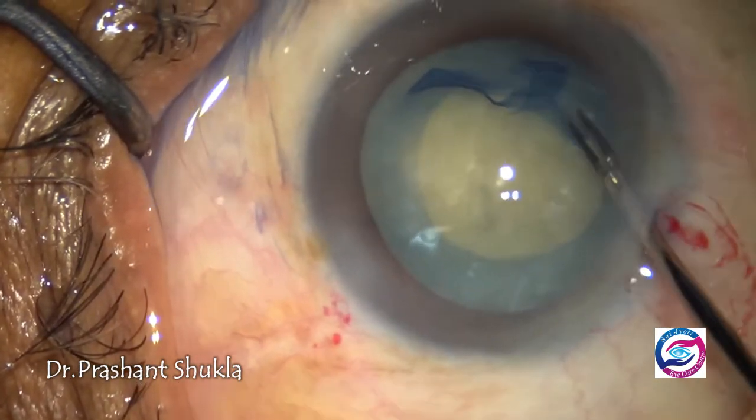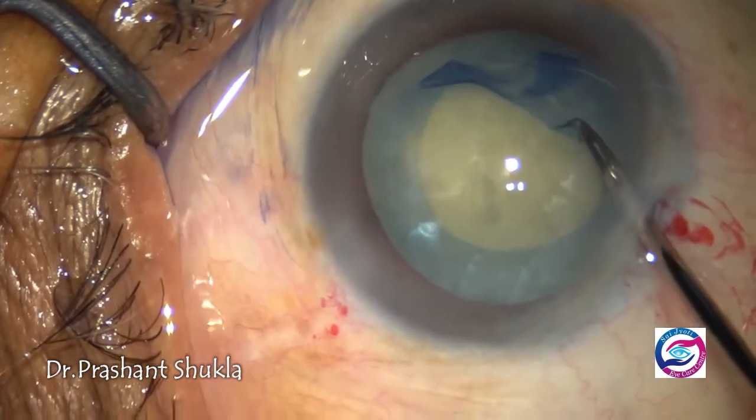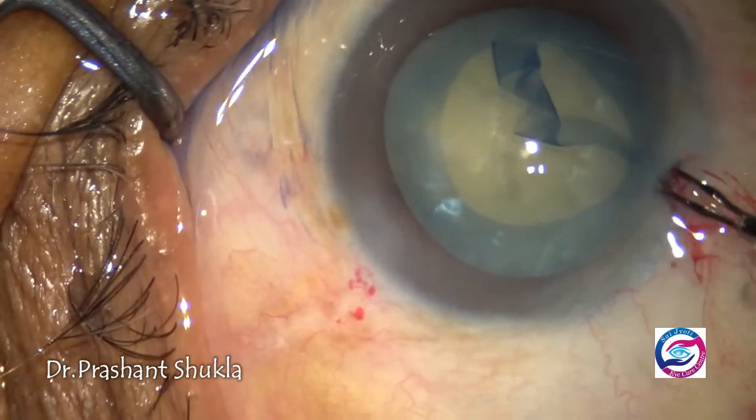With slow and controlled movements, I am able to make a secondary larger Rhexis of the size of about 5 to 5.5 millimeters.